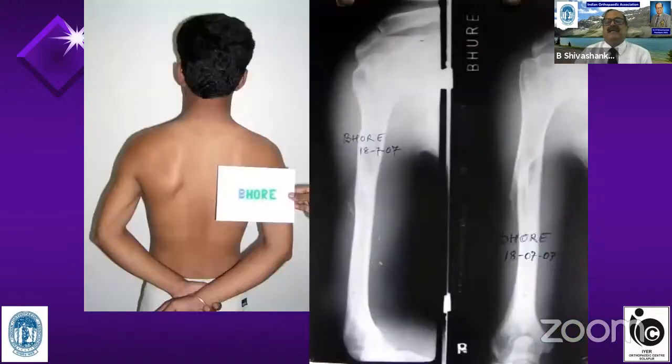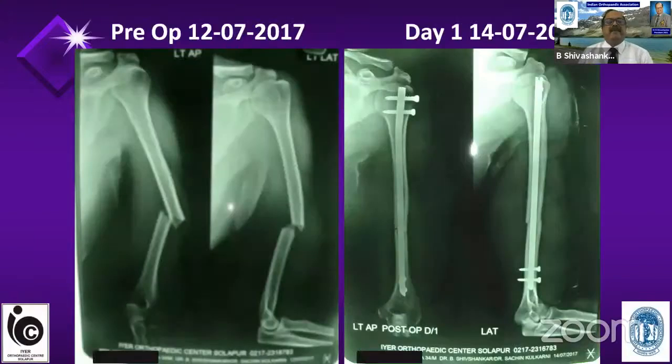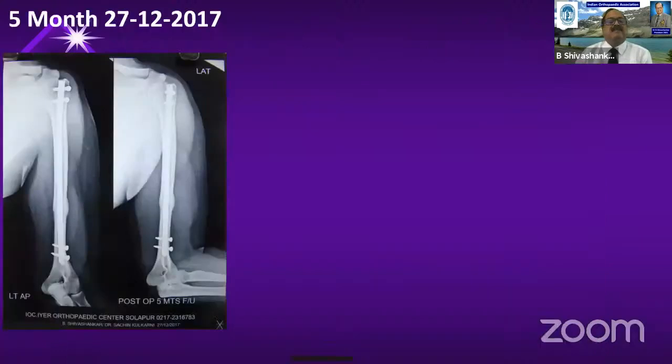Again, as I said earlier, I intend to remove all the implants which I have put in. Earlier, I was doing nailing with only 1 screw above and 1 screw below, but now I feel that 1 screw above and 1 screw below may cause some torsional problem, especially if the nail size is thinner than the canal size. So I have switched over to a 2 screw system, 2 screws proximally and 2 screws distally.